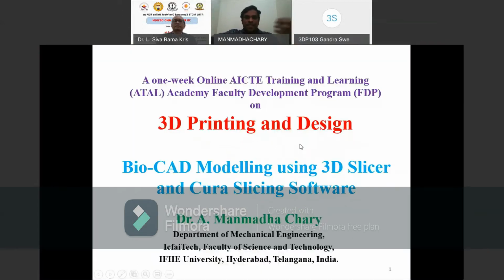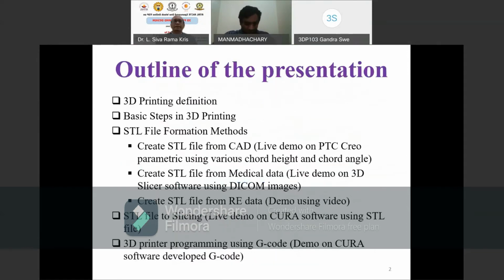Okay. Good afternoon. This is Dr. Manmadachari. Today I'm presenting on Bio-CAD modeling and 3D Slicer and slicing software using CURA. Please be a little bit louder, sorry.